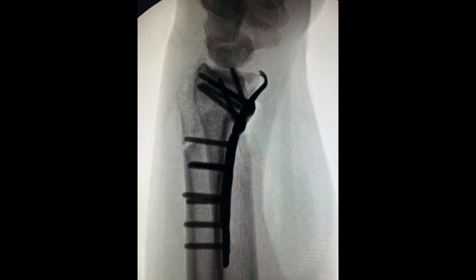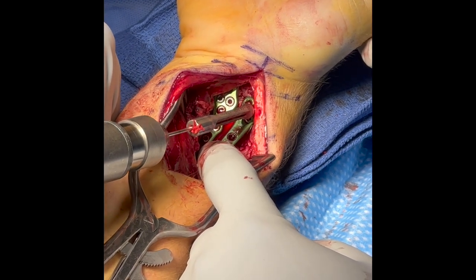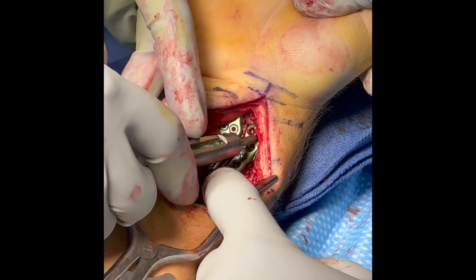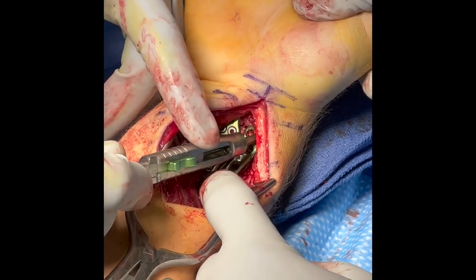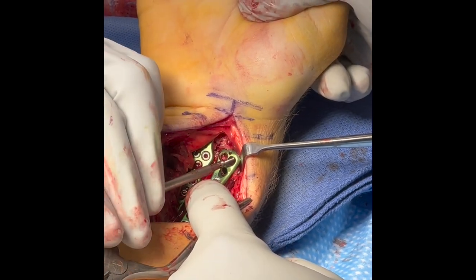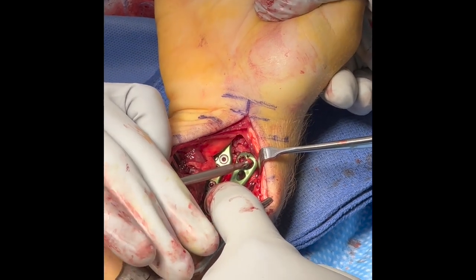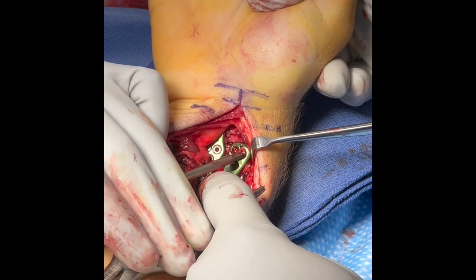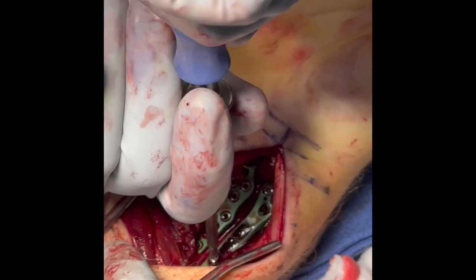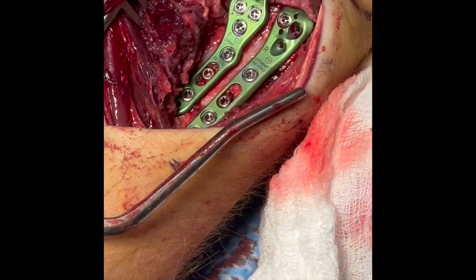The lateral fluorograph shows hook fixation to the lunate fragment, and now the additional screws are placed in the radial styloid plate. The remainder of the locking screws are placed. One can see how distal the lunate hook plate is to really secure that fragment. The last proximal screw is placed and the plate has been filled with screws.